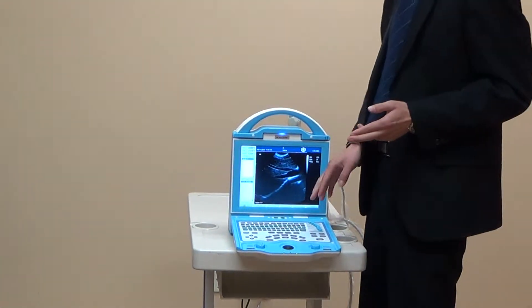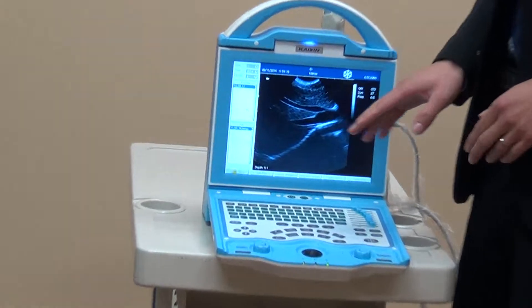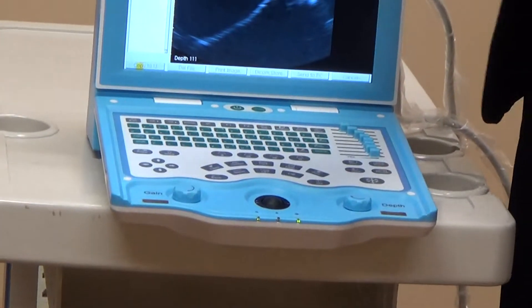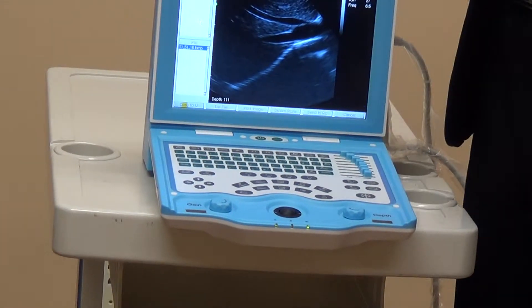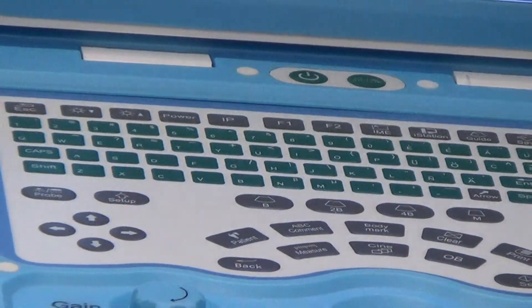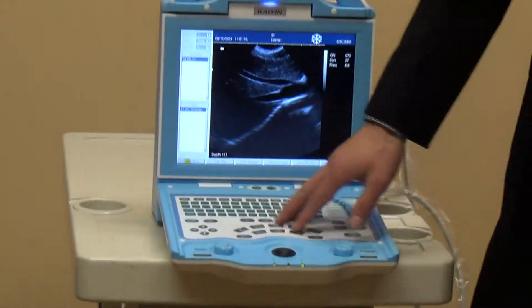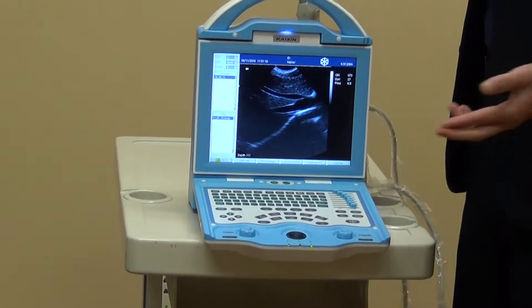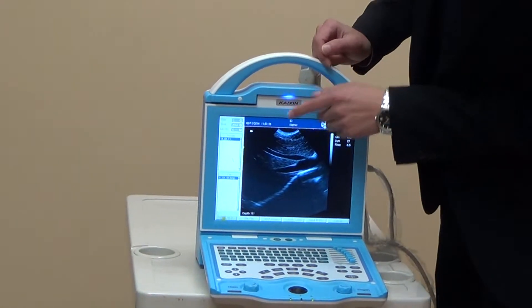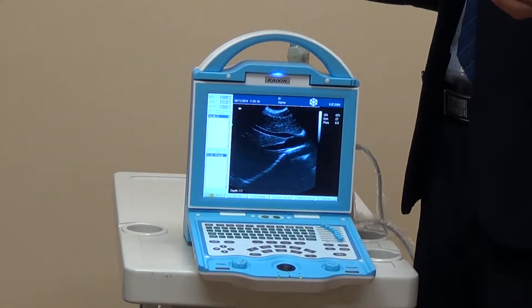Another advantage is the keyboard. This keyboard is anti-dust and anti-splash. For veterinarians, sometimes the environment is not so clean, so the keyboard is very easy to get dirty. That kind of regular keyboard is easy to be damaged — for example, some water gets inside and the keyboard will be burnt and need repair. But this one is anti-dust and anti-splash. Also, with the backlight, you can see the keys very clearly while working in a dark room. It is very useful.